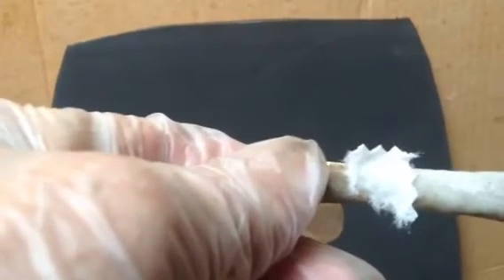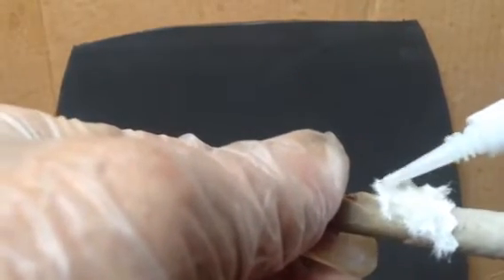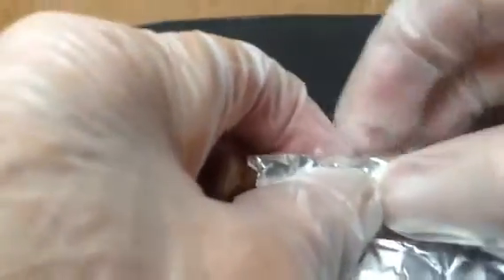Now that we've got the bone set in the right place, I'll just finish super gluing this around and hold it down while it's setting with the aluminum foil. The foil can just be wrapped right around it.